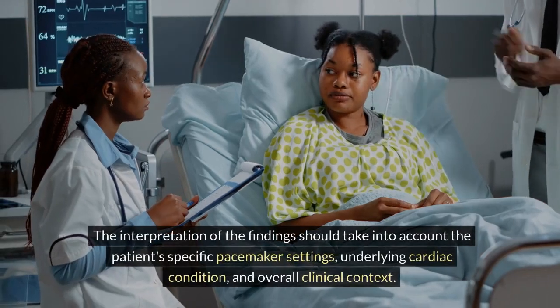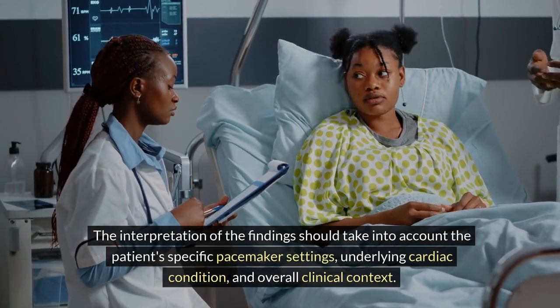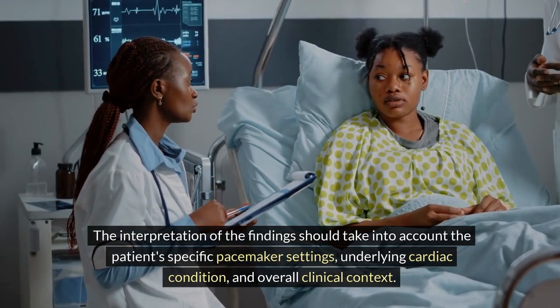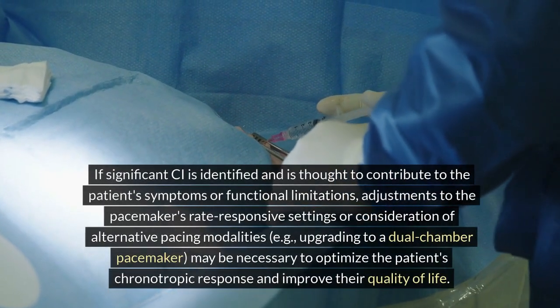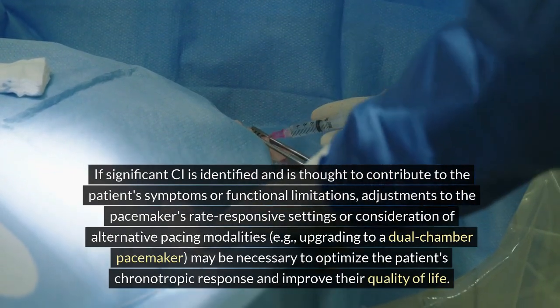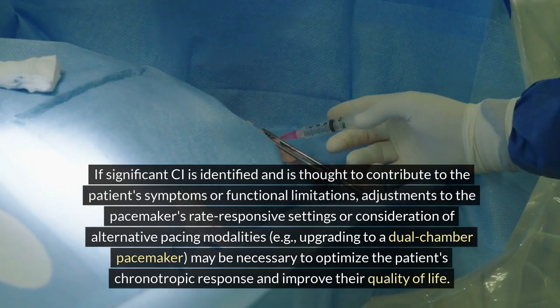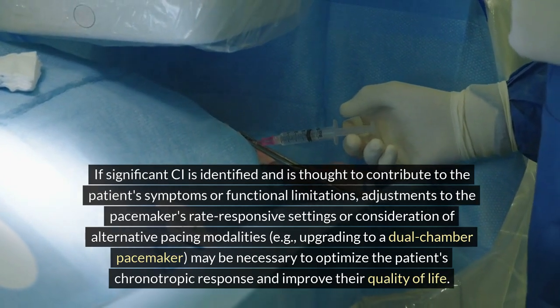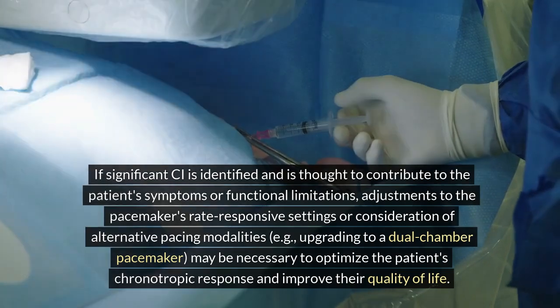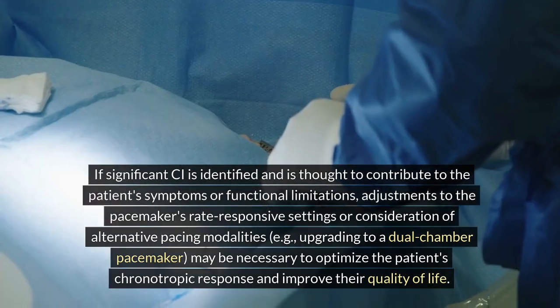The interpretation of the findings should take into account the patient's specific pacemaker settings, underlying cardiac condition, and overall clinical context. If significant CI is identified and is thought to contribute to the patient's symptoms or functional limitations, adjustments to the pacemaker's rate-responsive settings or consideration of alternative pacing modalities, e.g., upgrading to a dual-chamber pacemaker, may be necessary to optimize the patient's chronotropic response and improve their quality of life.